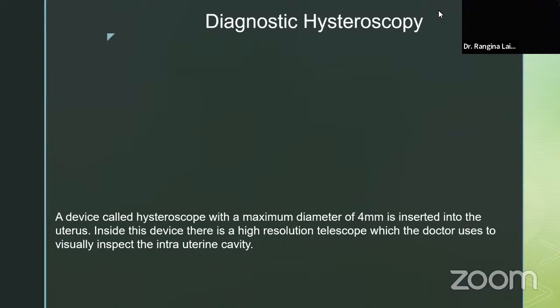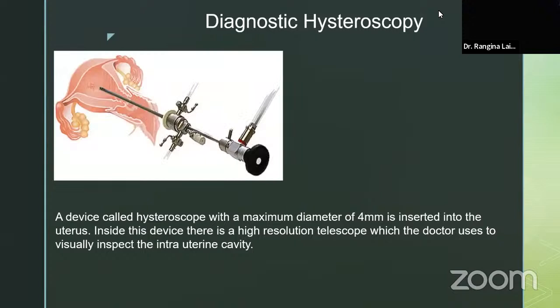Talking about hysteroscopy, let's talk about the instrument. There was a time when we used a 4 millimeter hysteroscope, and as I've already discussed, it is vaginoscopy, cervicoscopy, and uteroscopy, a combination of these three. Now we have scopes of 2.9 mm, and even mini scopes are available from different companies. With the help of these scopes, through the high resolution telescope, we can visualize the vagina, the cervix, and the uterine cavity.